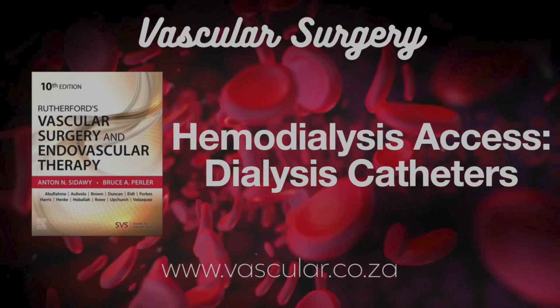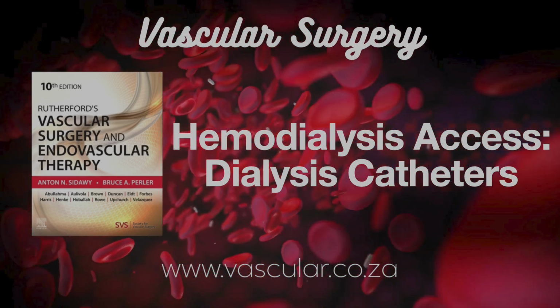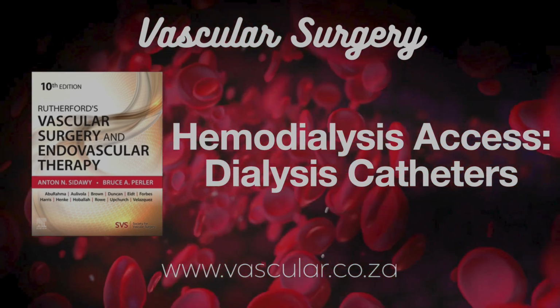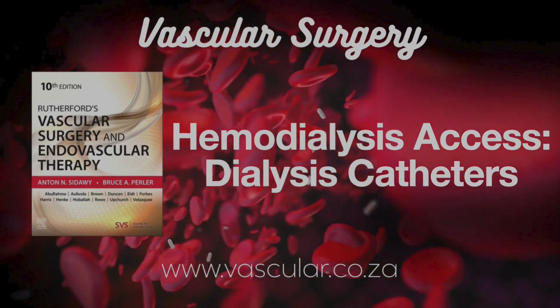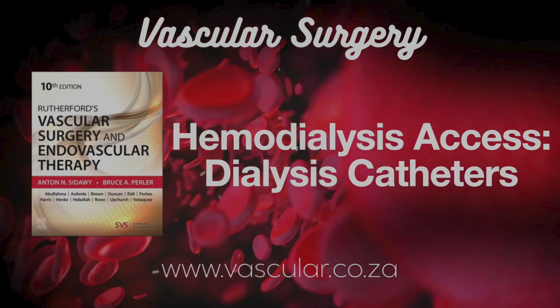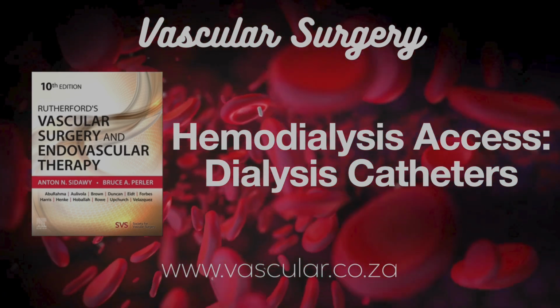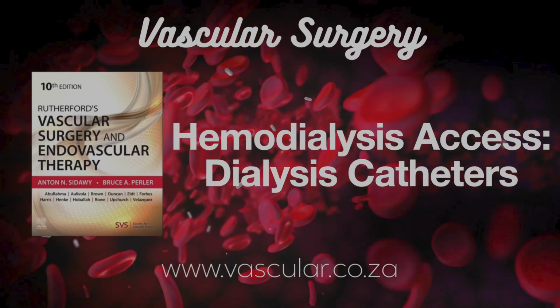How do you manage these clots? Suspect it with arm, neck, face swelling, prominent veins, maybe unexplained fever. Ultrasound usually diagnoses it. Treatment is anticoagulation, elevating the arm. Ideally, remove the catheter if possible, but if it's the only access, anticoagulation with the catheter in place is considered.